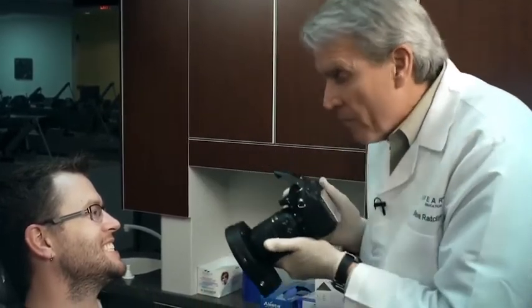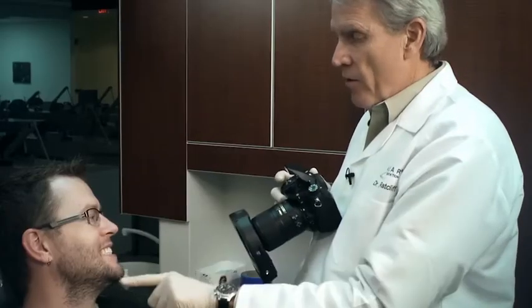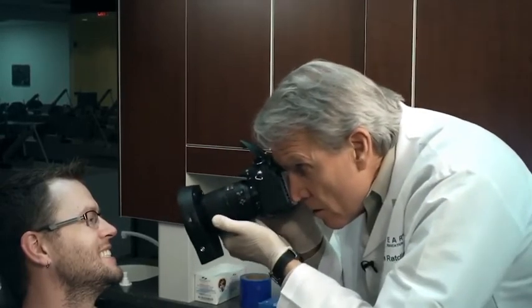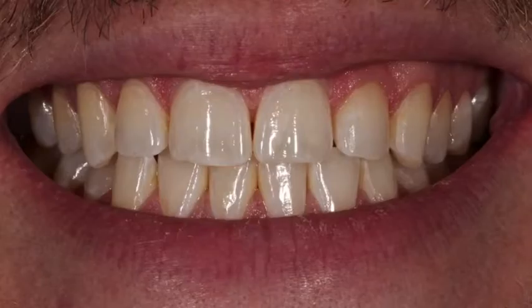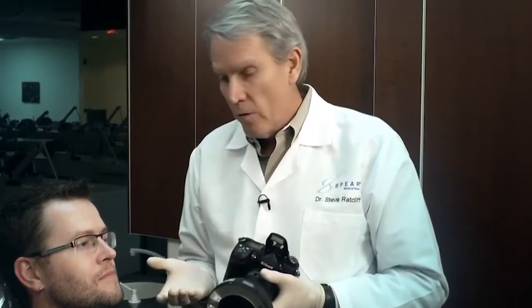Now I'm going to frame it. What I want to see is the sides of his lips, the corners of his mouth, his lower lip, this corner, and his upper lip. I don't want the nose or the chin or his cheeks in this photo. So smile big, more, act like you believe it. Okay, thank you. So those are 2 of the 6 shots that we'll take. You've learned how to do a retracted shot with the teeth apart, and you've learned how to do a natural smile shot. Thank you.